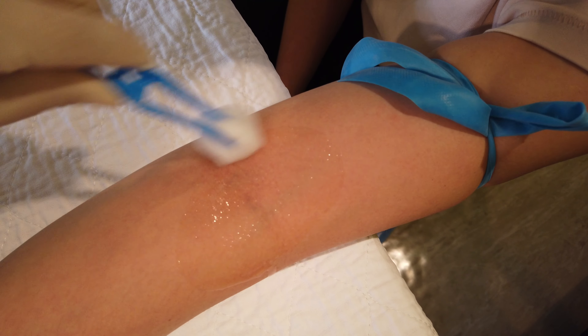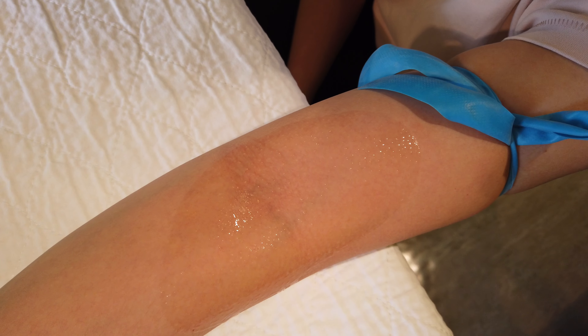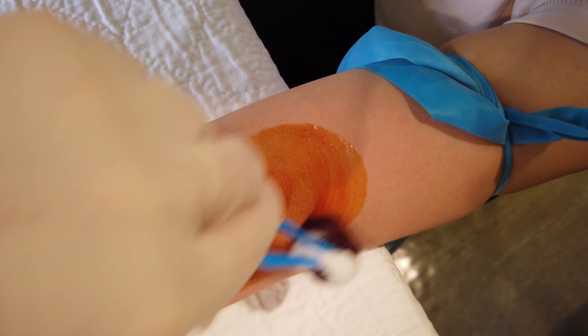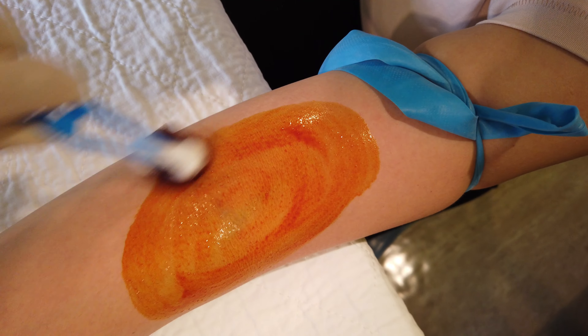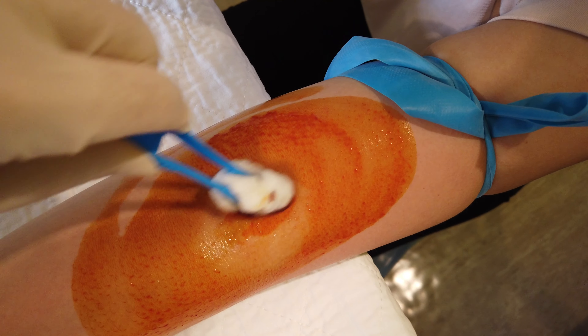Using two cotton swabs soaked with isopropyl alcohol, prep the skin in a circular motion from your venipuncture site outwards. Allow to air dry for 30 seconds, then follow with povidone iodine. Let air dry for 2 minutes using a similar technique.